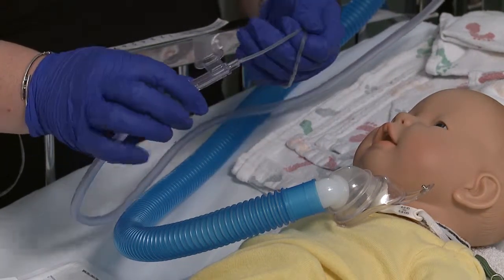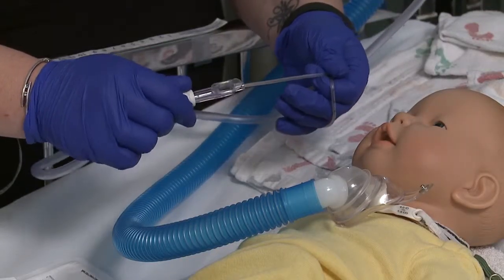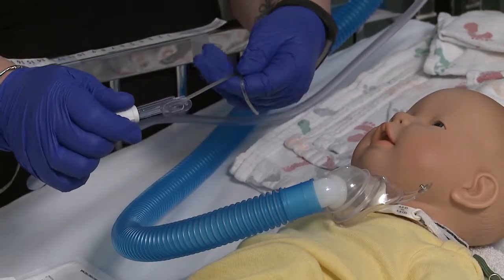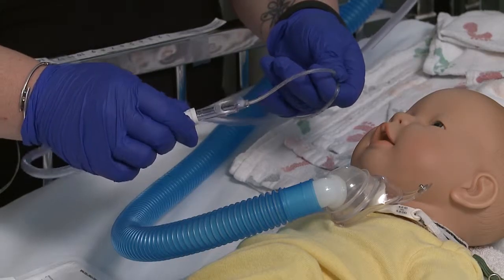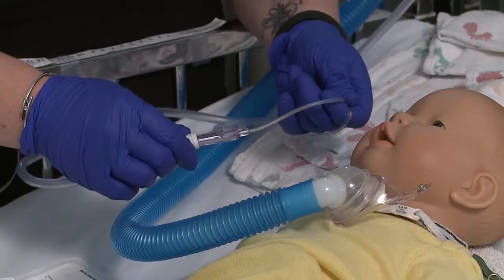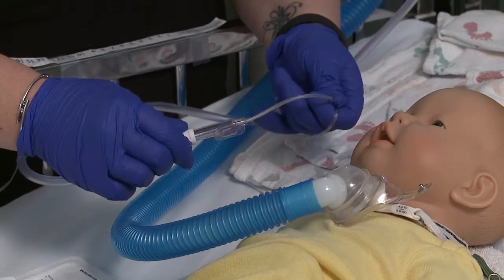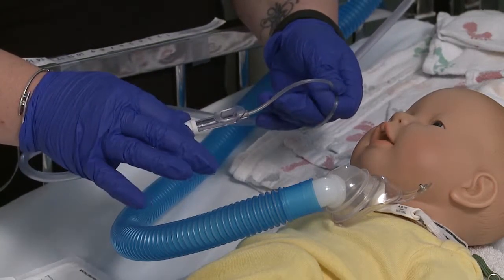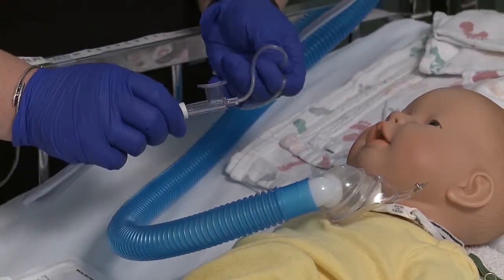You may need to repeat suctioning as necessary to clear all the secretions. This catheter is for use at home as many times as you need as long as you keep it clean. In hospital, it's one incident per catheter kit.